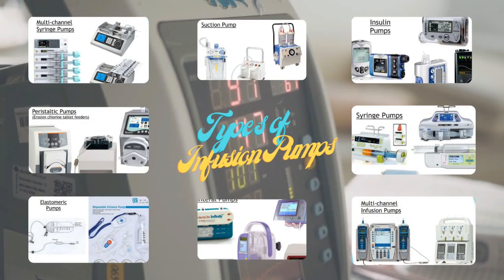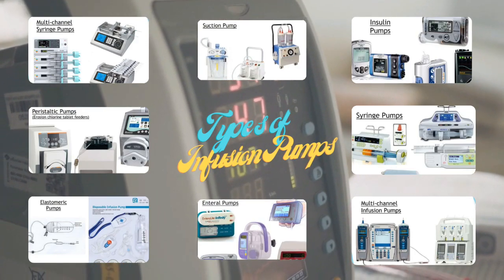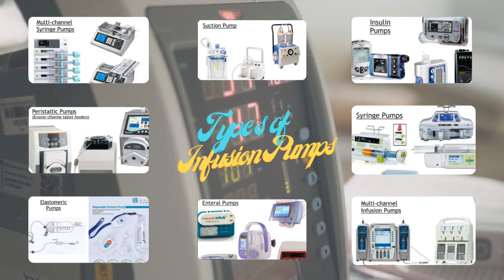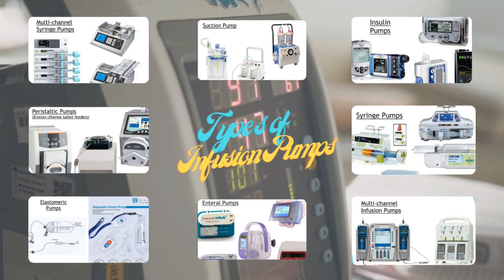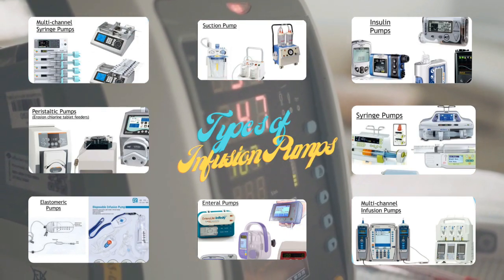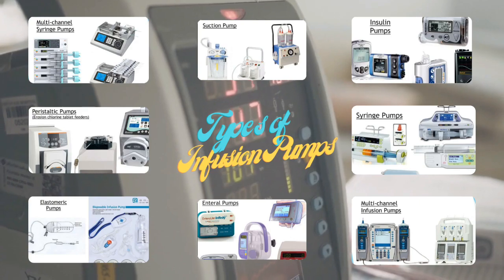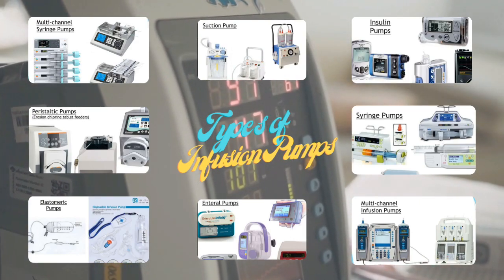There are two types of infusion pumps when it comes to using. Specialty pumps and regular pumps are examples of these. Specialty infusion pumps are created to meet the demands of certain medical situations. They are frequently utilized in the delivery of home care or the treatment of certain illnesses, such as diabetes. The following are three main classifications: implantable pumps, enteral pumps, and insulin infusion pumps.